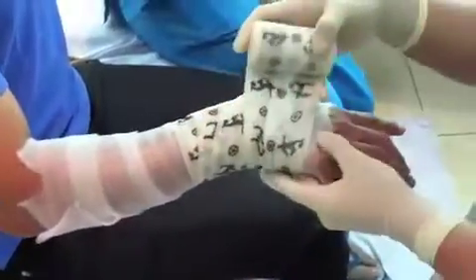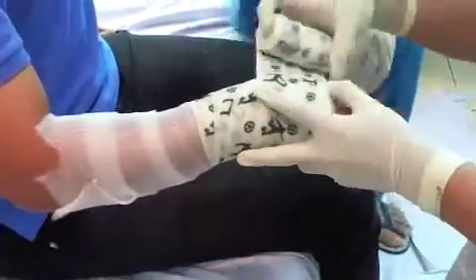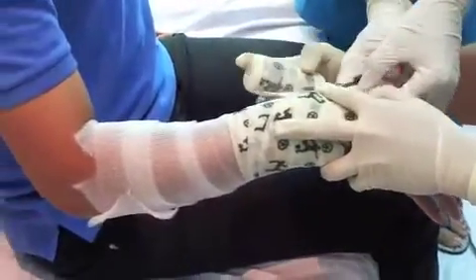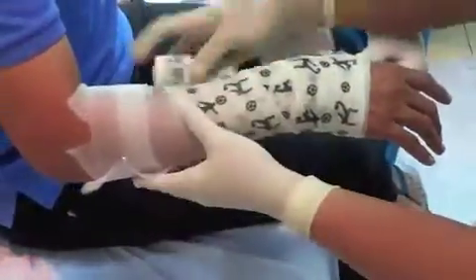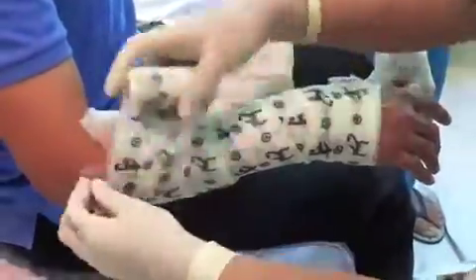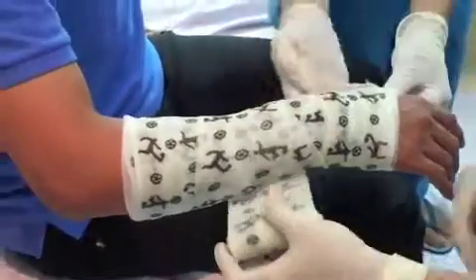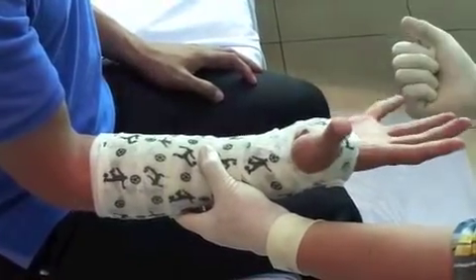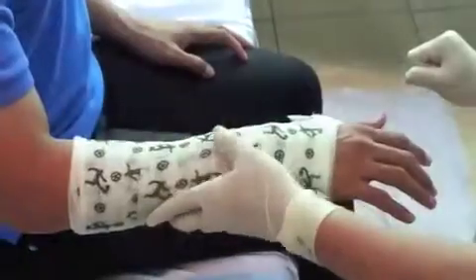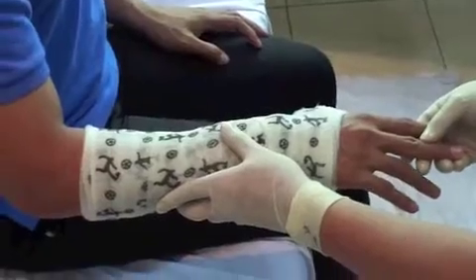We trim the cast to make it more anatomical, and at the distal we tuck and bend the padding a little bit to protect the skin from the cast. We make it very nice, then go to the proximal side and tuck and bend the padding so it will protect the skin. We cut it at the end and make sure that movement is not restricted — the flexion and extension of fingers on the palmar and dorsal side — checking that the cast edges will not restrict movement.